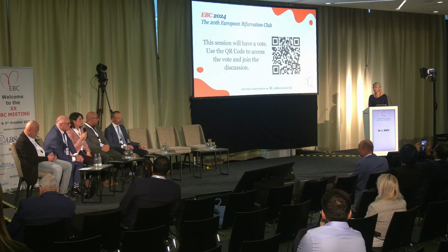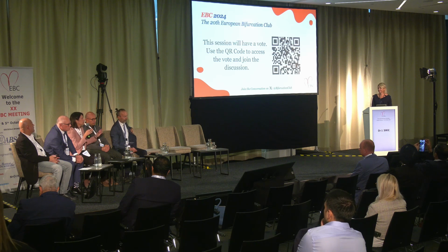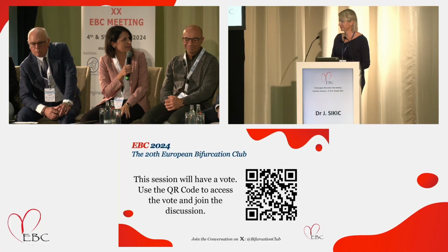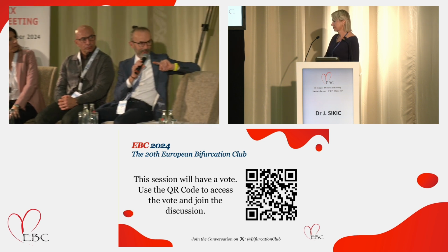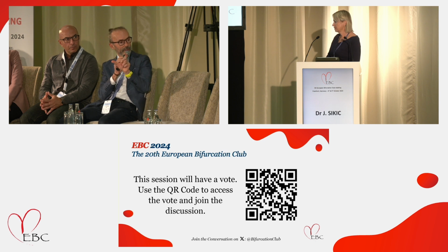No, it's a really good example. I really liked this occlusion of the LAD, which is solved with the cutting balloon and the DCB. For me, this is the major point: a lot of tools in one artery, and with the final good result. I had one question. So you stented the LAD, but you stented also where you did the mid-LAD. No, the stent, there was already a stent there?